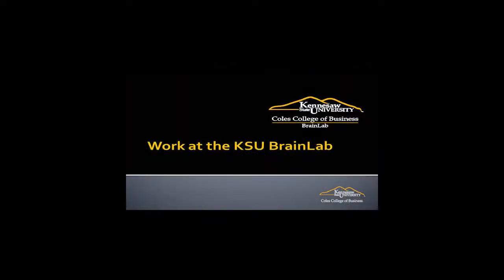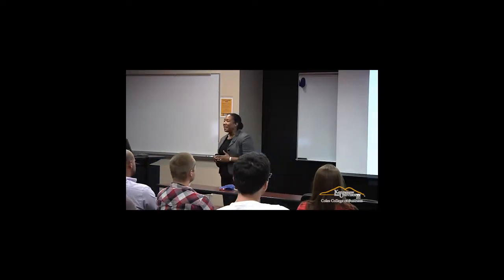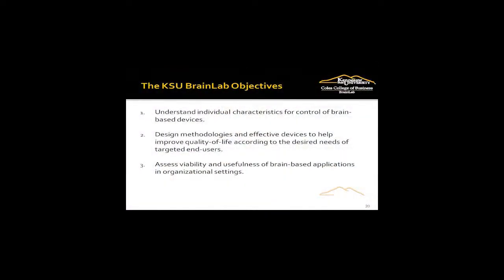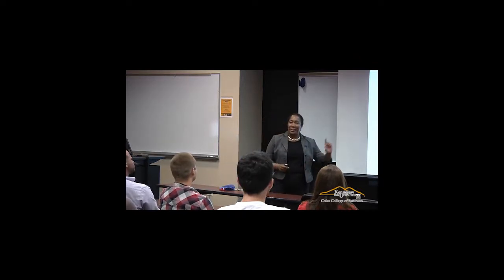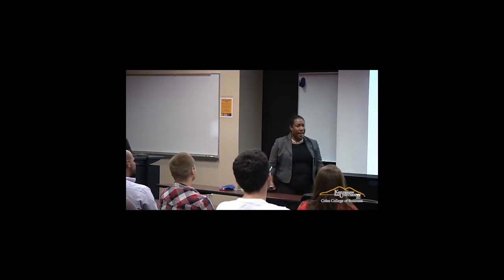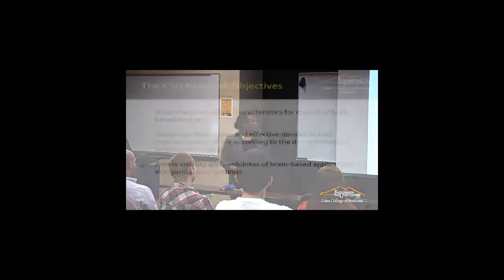So what are we doing upstairs on the second floor? Ultimately, it's looking at these pairings, this better fit of brain-computer interface technology to individuals. I'm looking at age, gender, do you smoke, do you drink, things that affect you physiologically, and how they impact these different techniques. If we're talking about something related to blood flow, well, if you're an athlete, you've got blood flowing through your veins a little more efficiently than some of our more sedentary counterparts. So if I put those two together, the person that's more active would probably be more efficient at controlling an interface based on that manner.